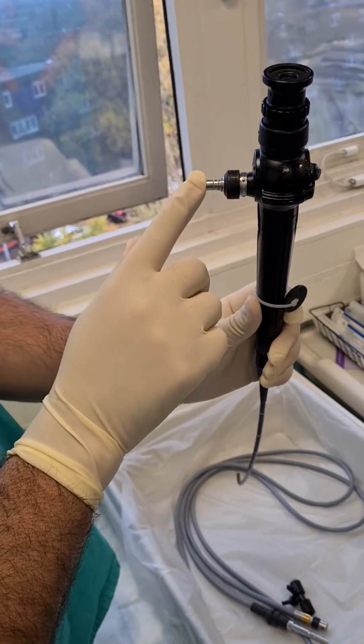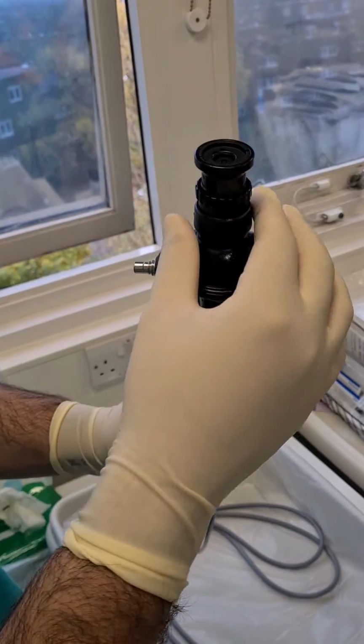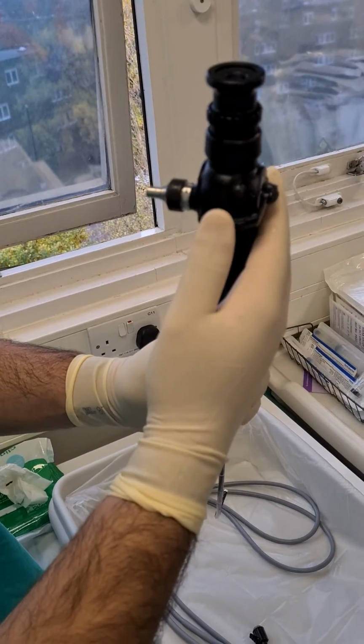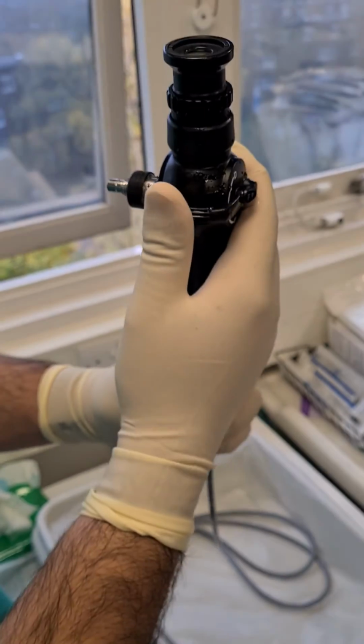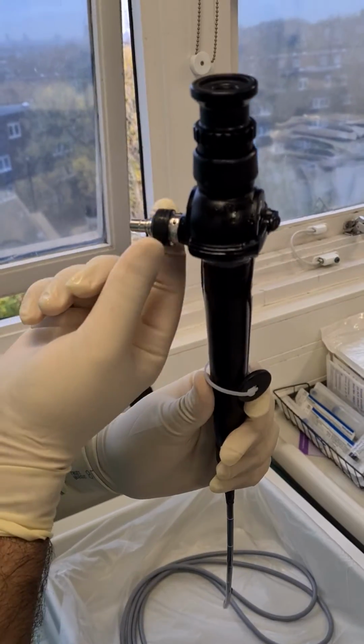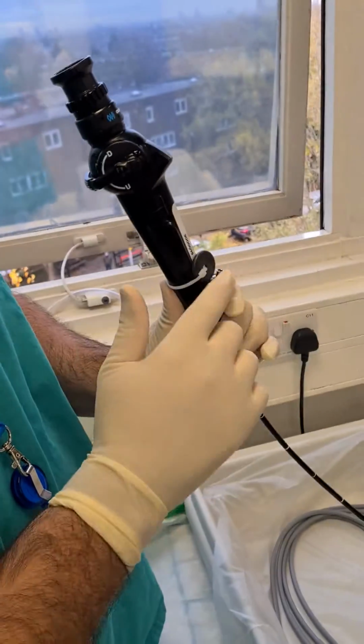This is for the light source. So this is the ocular window, the ocular lens. This is for the focus of the camera. This is the handpiece for rotation of the shaft. This is for the light source, and this is the working channel.